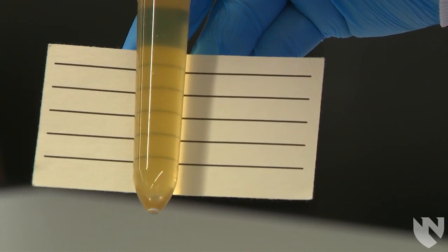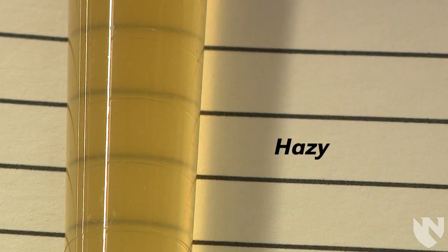The next urine is considered hazy. With the hazy urine, you can still see the lines on the card but you might also see some physical particles in the urine.